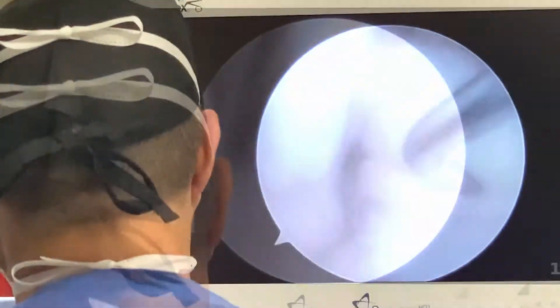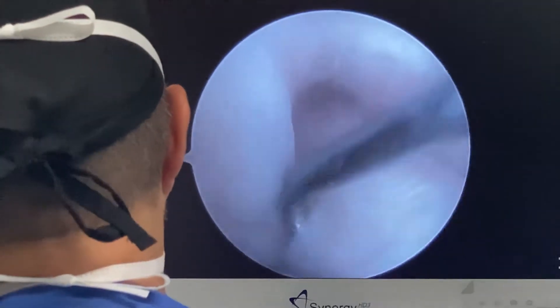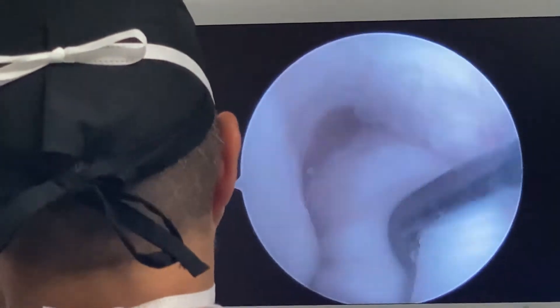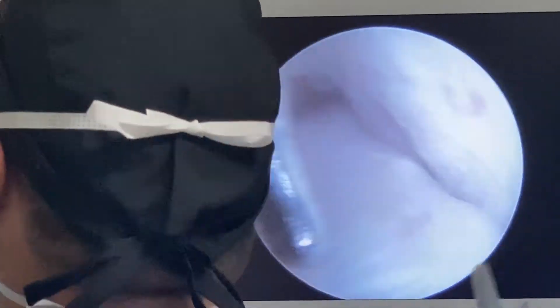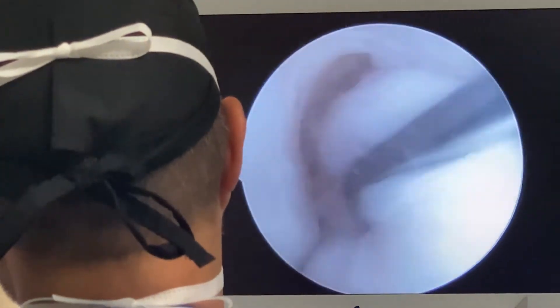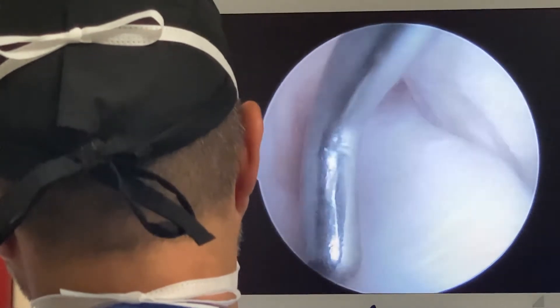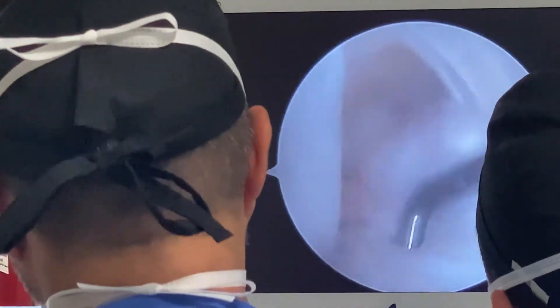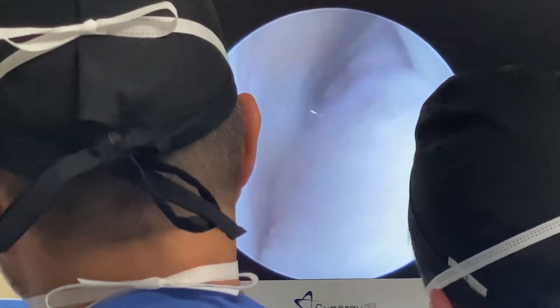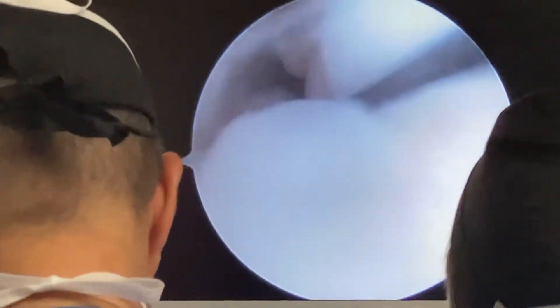So this is a nurse from an orthopedic hospital who came to me for an opinion because she had an ACL reconstruction done many years ago. This is the ACL and it doesn't seem right. The attachment of the ACL onto the femur — it's not bad, but it doesn't feel great. And when I did a physical exam called the pivot shift test, it seemed abnormal, so I'm concerned about that.